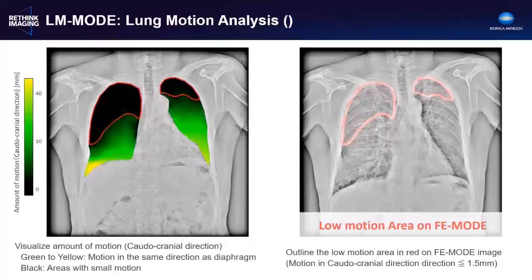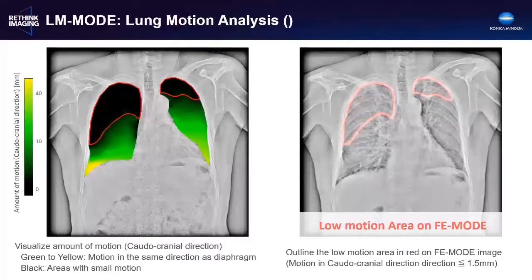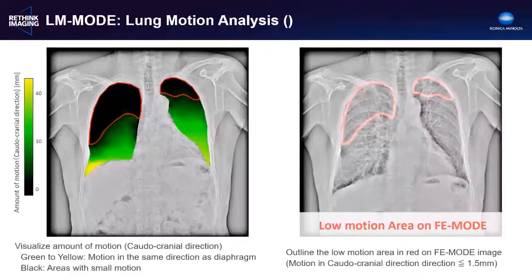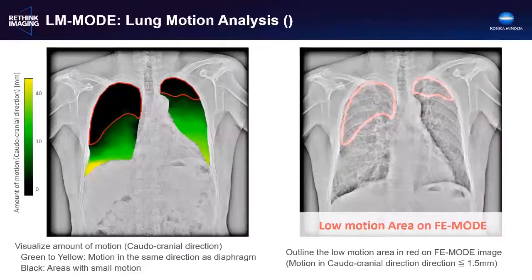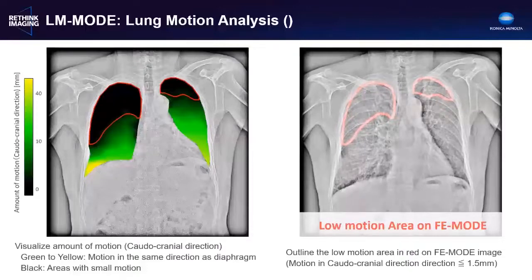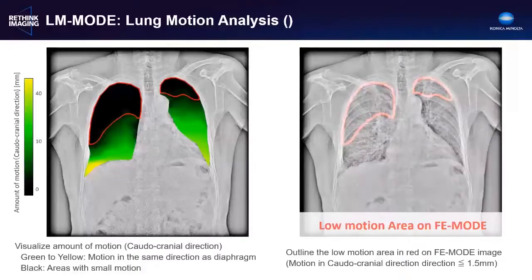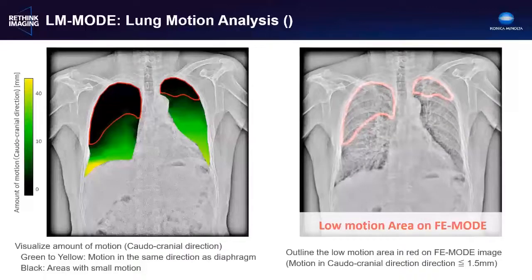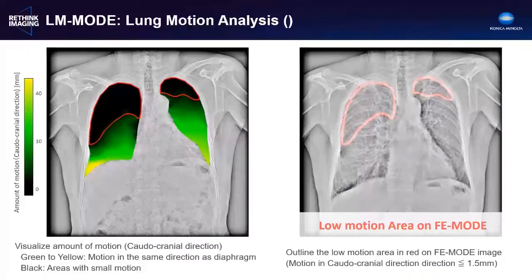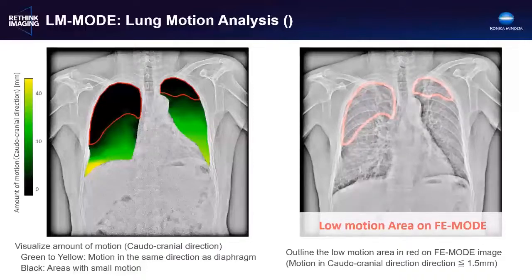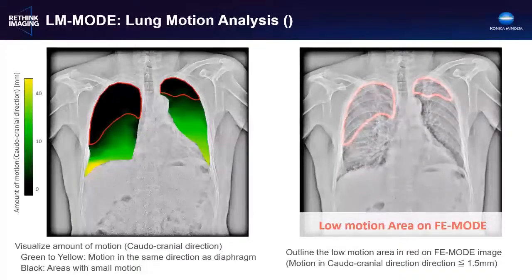Another advanced analysis tool is the use of an optical flow algorithm to quantify motion of the lung in the cranial-caudal direction. The amount of motion during respiration is shown using a green color scale, from areas of no motion shown in black, to areas of up to four centimeters of motion in bright chartreuse. Areas of very low motion, less than 1.5 millimeters, are highlighted and superimposed on a frequency-enhanced dynamic image. Published studies have shown this to be useful in detecting adhesions to the chest wall and evaluating pulmonary dynamics after surgical interventions.